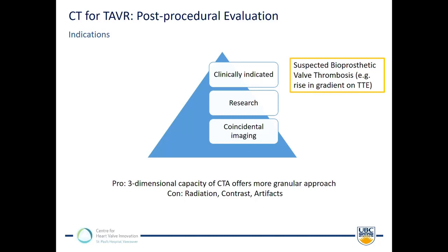So most important, I think, from a clinical practice point is to have a good post-discharge echo, to have a baseline gradient after TAVR, and then on follow-up, or if the patient becomes symptomatic and there's an increased gradient, there may be a suspicion for thrombus, then I think a CT is clinically indicated. And then, of course, sometimes you perform CTs for other indications, such as mitral imaging prior to a transcatheter mitral valve or mitral valve repair.